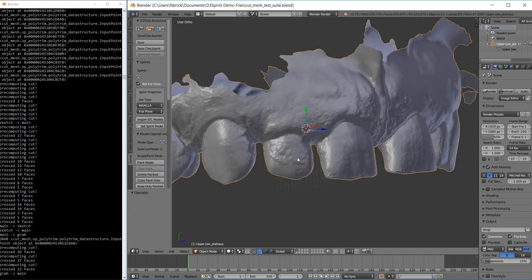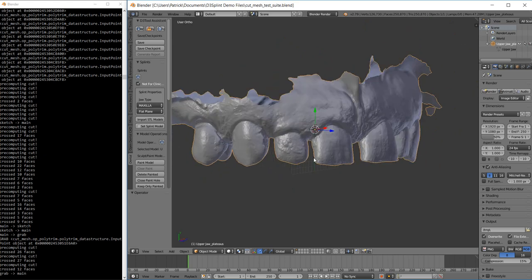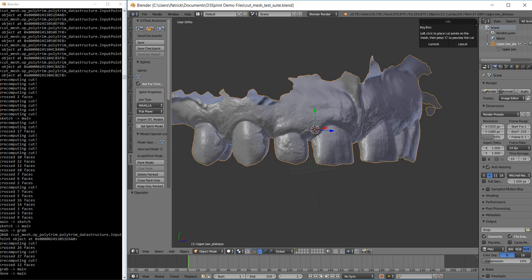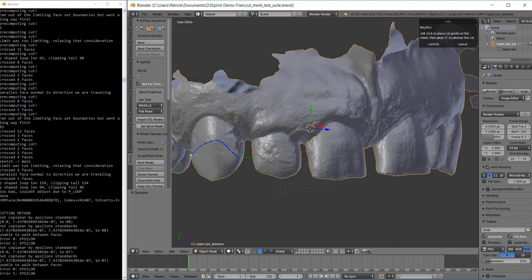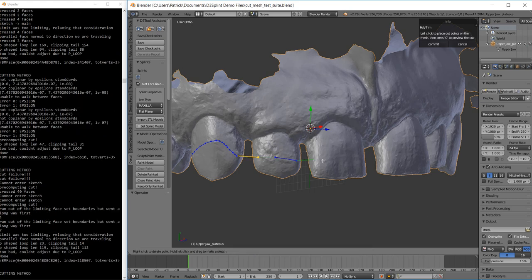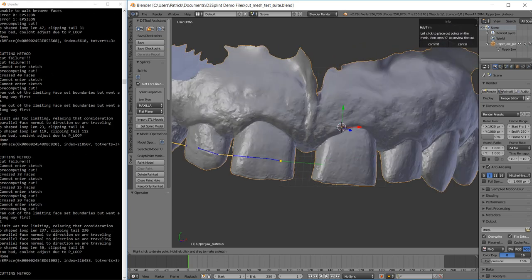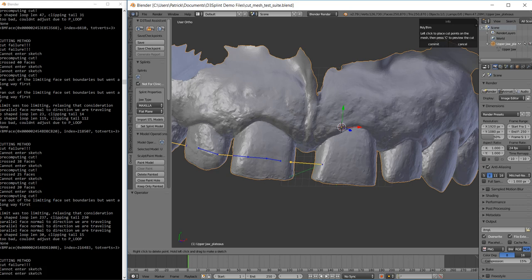Another big thing that we have trouble with is diastemas and little islands in the mesh, or tunnels rather. If you had a contact where the person had a lot of recession, you end up having a tunnel through the mesh, and that gives cutting algorithms all kinds of grief. So I'll show you here how we're handling the bridging gaps problem. What it'll do is do its best to try and find itself across the gap, and it kind of chews on it for as long as it thinks is prudent.